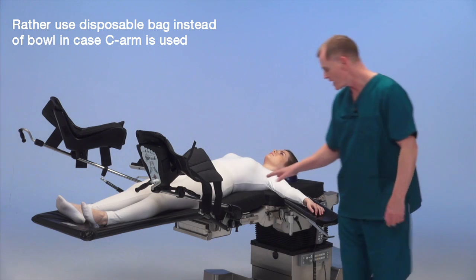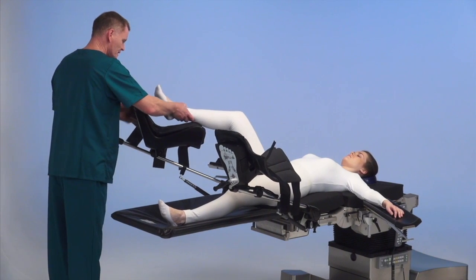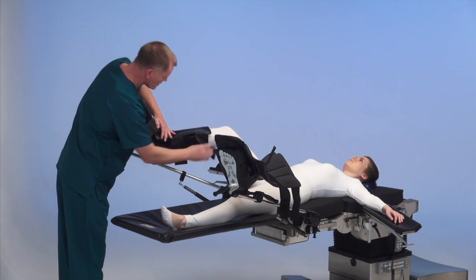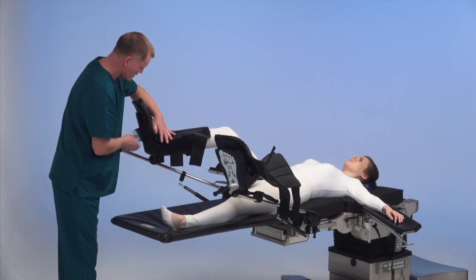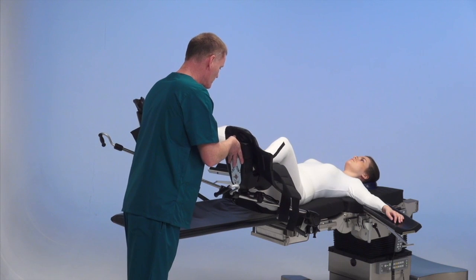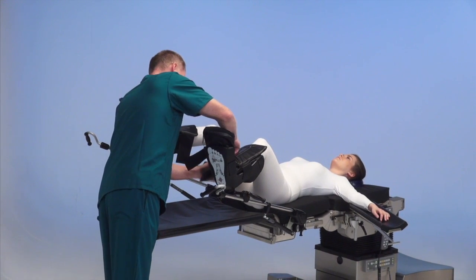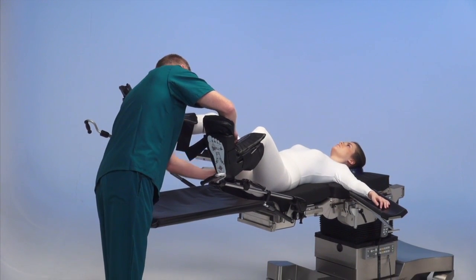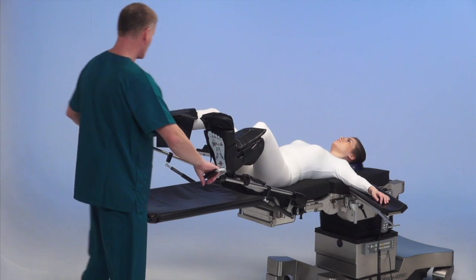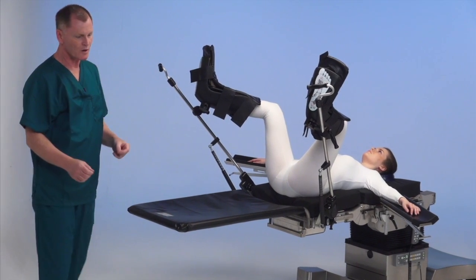Once we've got the patient situated, we're going to place the legs into the stirrups and strap them down — foot against the bottom of the stirrup and good support up under the thigh. Patient is now up into lithotomy.